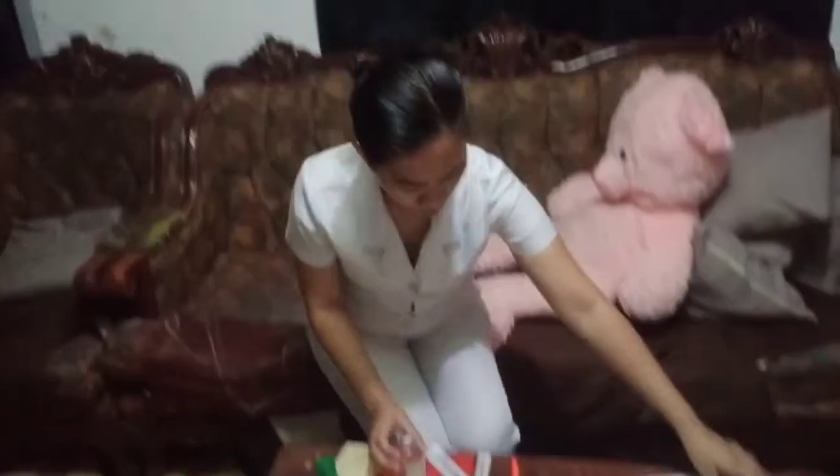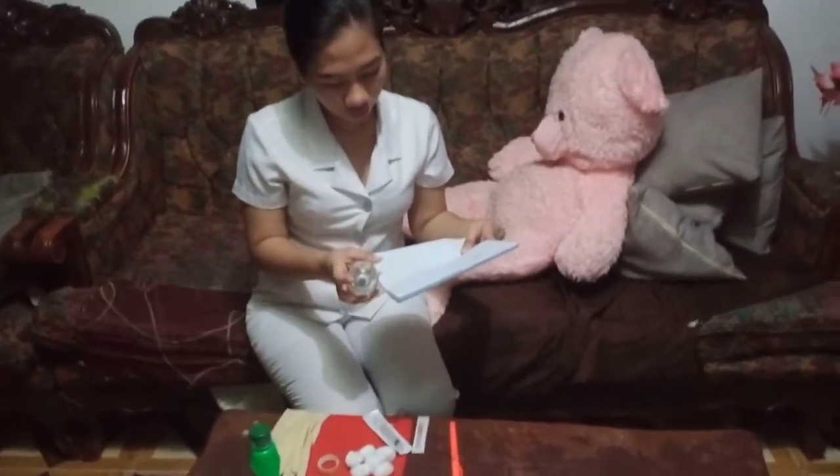Check the medication administration record to make sure that the correct medication is being prepared. Then check the labels on the medication carefully against the MAR to make sure that the correct medication is being prepared. Then follow the three checks for administering medication.